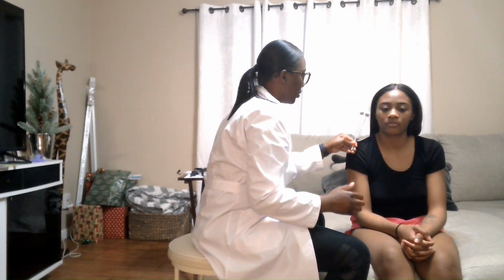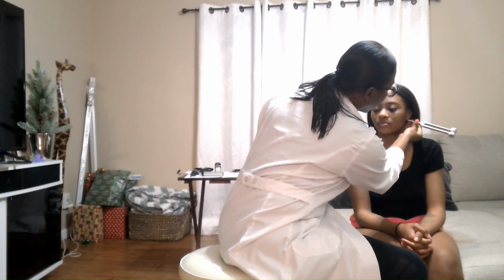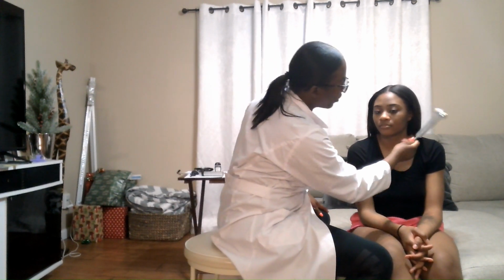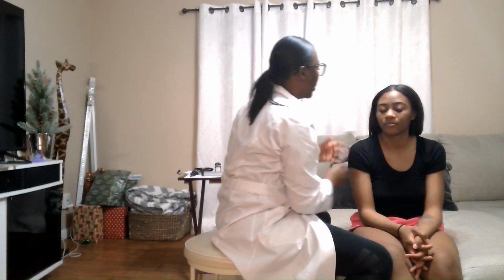Feel it? Yeah. Can you still hear it? Yes. Feel it? Yeah. Can you still hear it? Yes. And then tell me, is it louder? Which one is it louder, 1 or 2? 1.